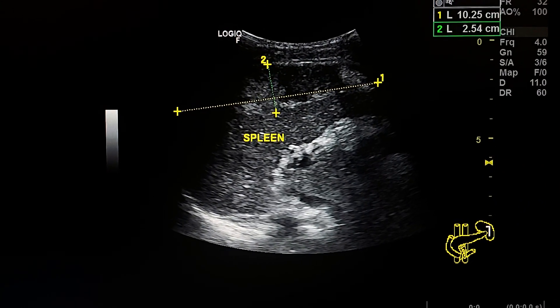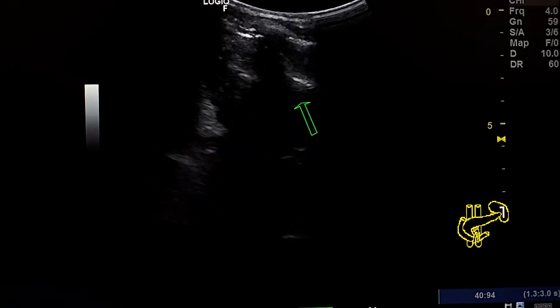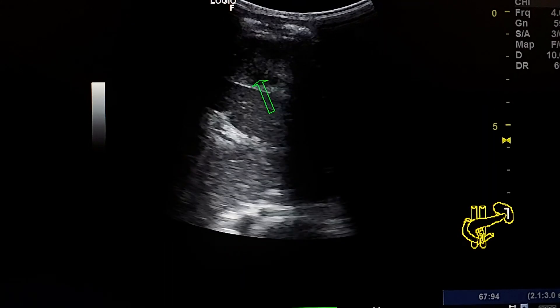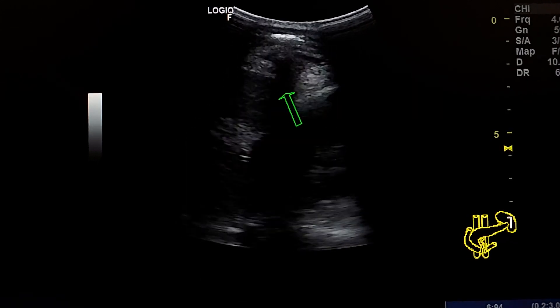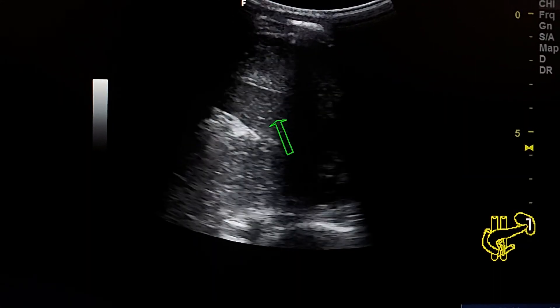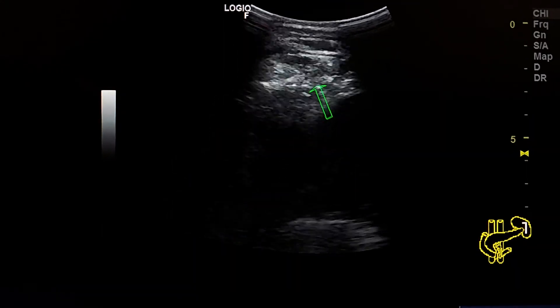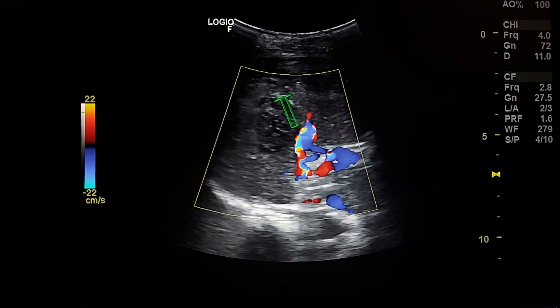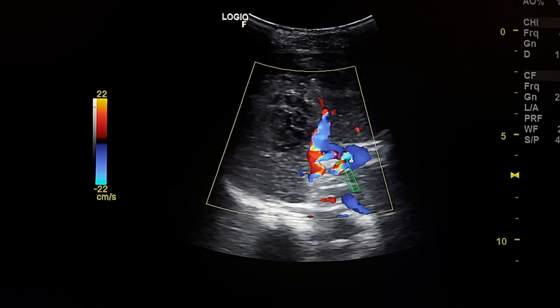This is a subcapsular hematoma in the spleen, shown in transverse section. We see a heterogeneous area extending on the lateral surface of the spleen. This is the normal echogenicity of the splenic parenchyma, and this is the subcapsular hematoma, which is heterogeneous. By Color Doppler, we don't see vascularity inside this area.